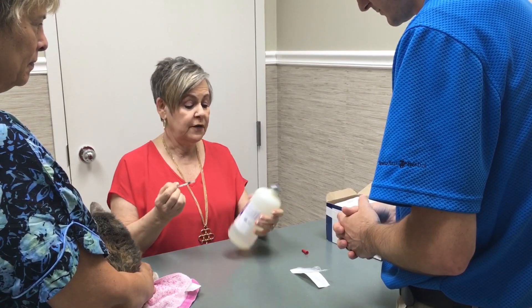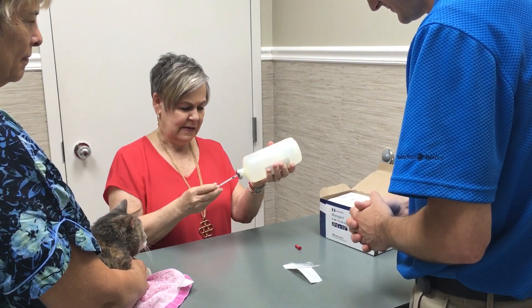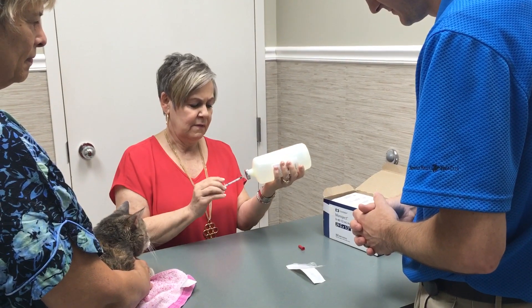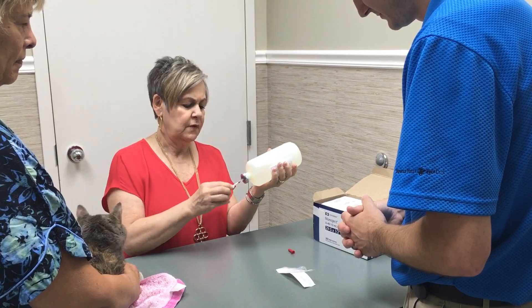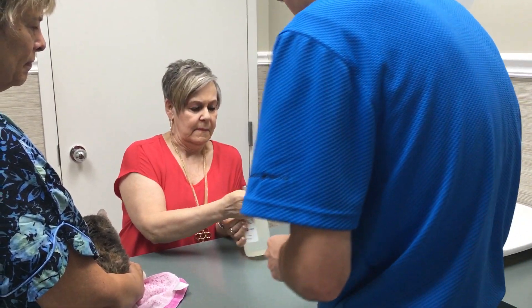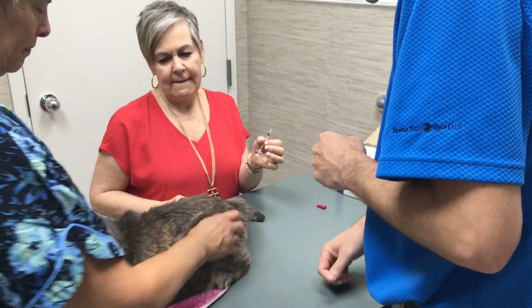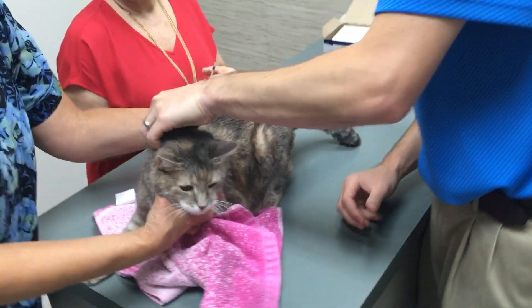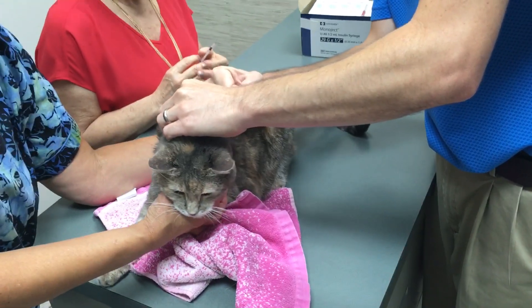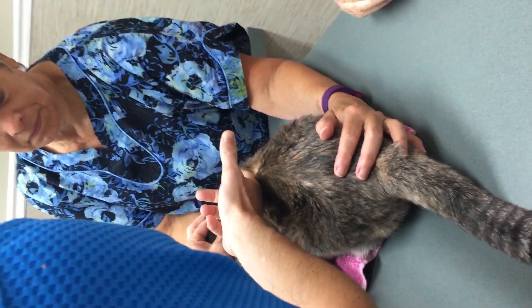No cleaning first. There is one. Now we are going to actually get our injection. Are you right handed? So what I like to do is my left hand — I pinch the skin up and create a little pocket. That is my aim right there between the two index fingers. You see the little pocket there? And then we take my right hand with the syringe, we touch against the skin, and pop through the skin.